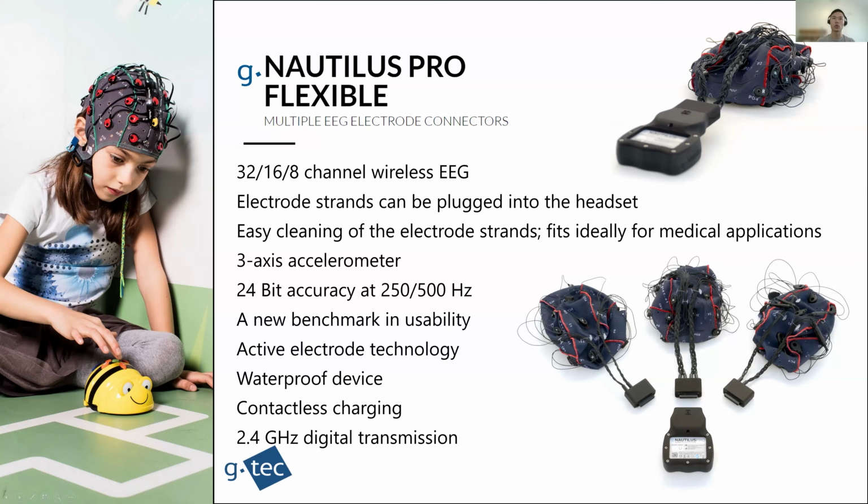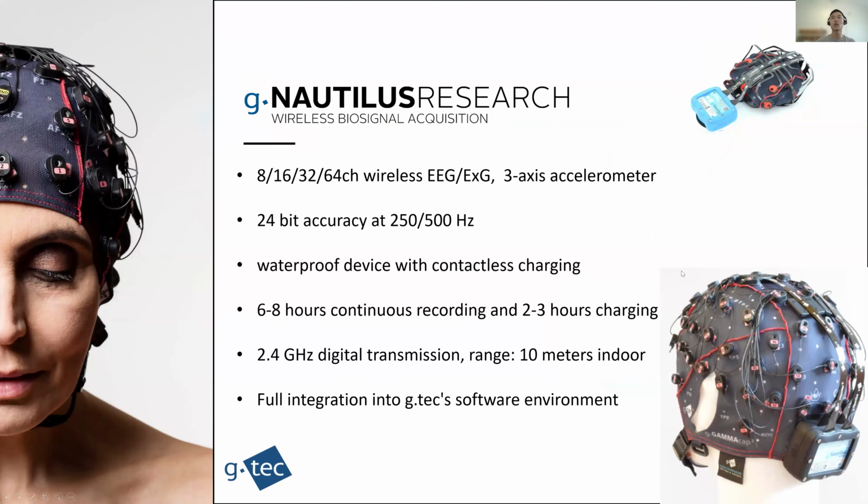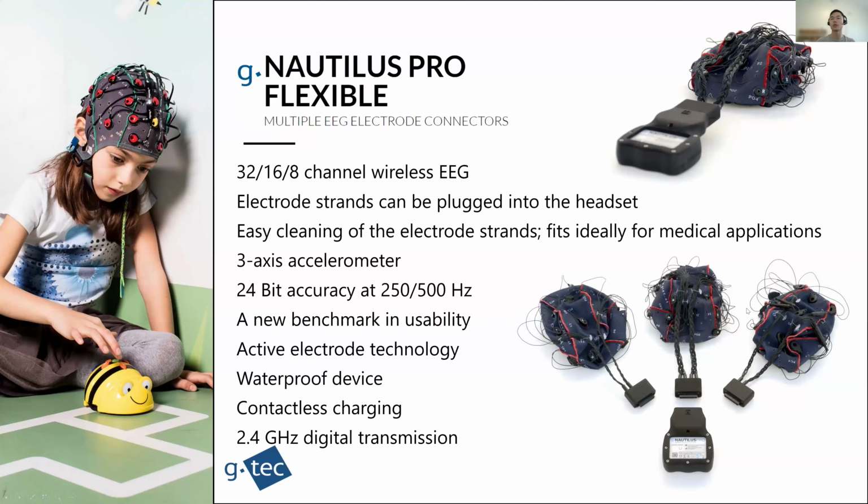This is really ideal for clinical use. Imagine there are patients coming in having different head sizes and different needs of the strand. Maybe the positioning of the electrodes is different, or maybe the type of electrodes is different. So you can easily pick up the cap you need and use it on patient A. When patient B comes in, you just swap the cap for patient B. So it's really convenient. And the good thing is, you can also make it a multi-purpose version. I will show you later on.